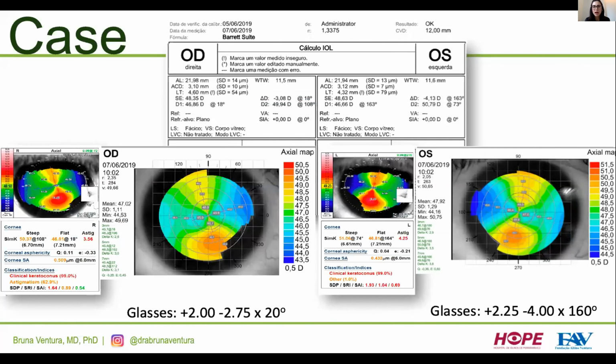When we went to the left eye, the IOL Master 700 measured 4.13 diopters with-the-rule astigmatism. The OPD measured 4.25 with-the-rule astigmatism. And again, the ISIS measured a much lower astigmatism, but agreeing with regards to the meridian.